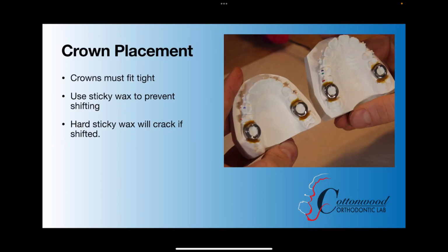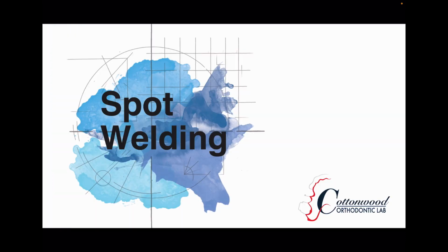Next, we're going to move on to crown placement. I can't stress enough how much these crowns need to fit tight. We crimp all of our crowns. There should be no movement. Just to ensure there's no movement, we always add sticky wax to help prevent any kind of shifting. The sticky wax is hard and brittle, so it will crack if any of those shift, and it's always a good indicator that that's happened.